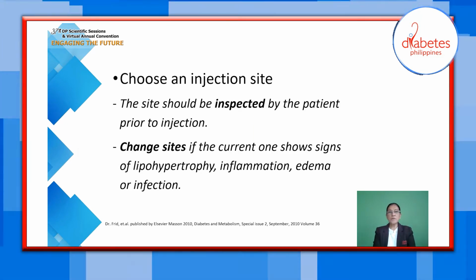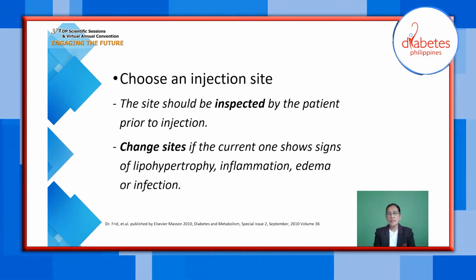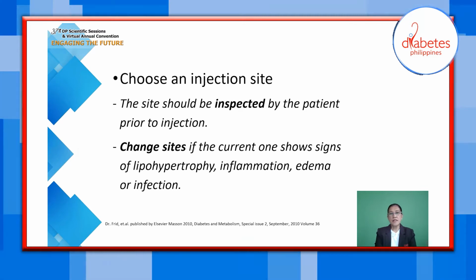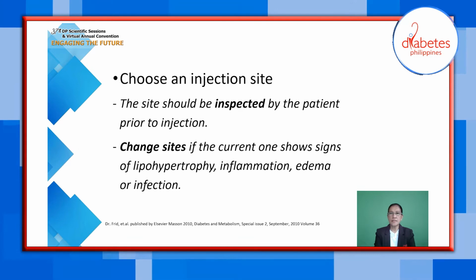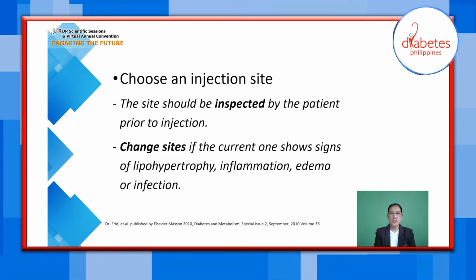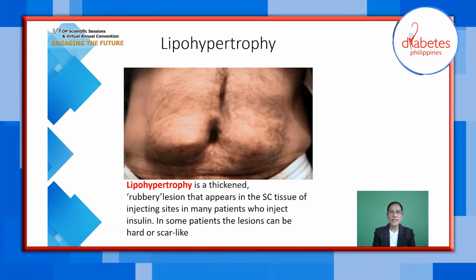We have to teach the patient also how to inspect the insulin site, and if there are signs of lipohypertrophy, inflammation, and edema, or signs of infection, please advise the patient to rotate the injection site. So what is lipohypertrophy?